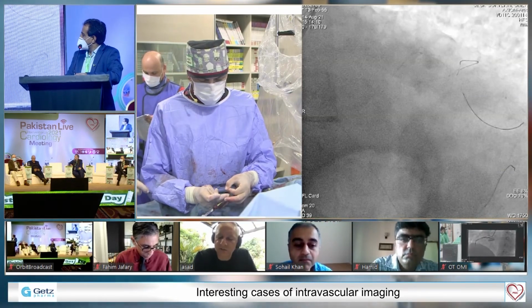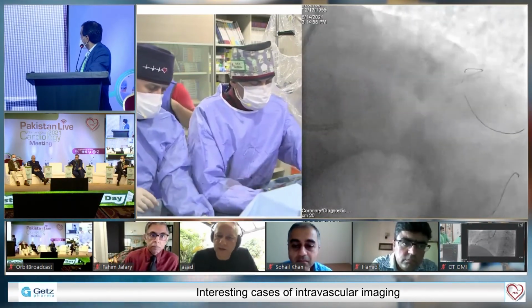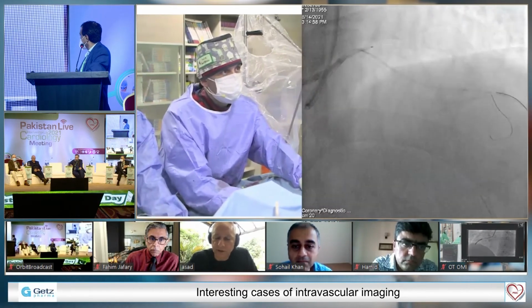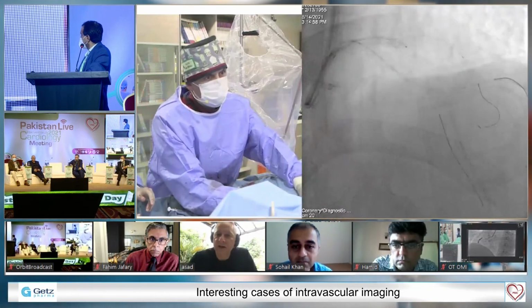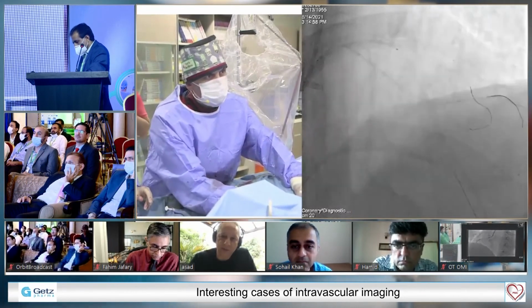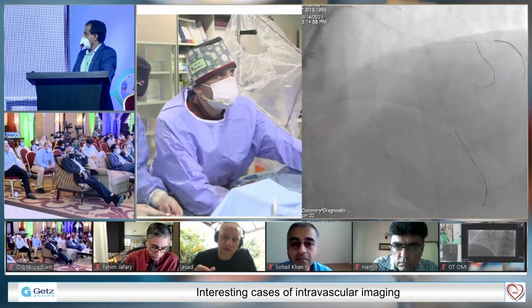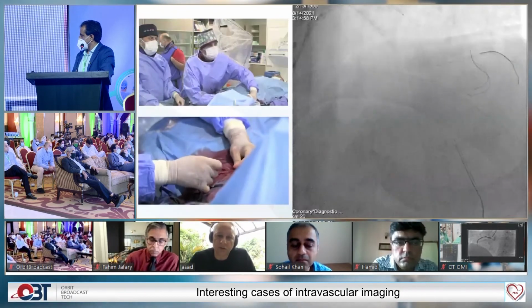As far as safety, clearly the safest retrograde option is to go through a vein graft, then septal, and finally epicardial. They recommend that you should only attempt an epicardial once you've done at least 50 retrograde cases, because the epicardial is a lot more fragile and the risk of injury and perforation is much higher. Plus with epicardial, they nearly always tamponade, whereas septals a lot of times are not serious complications. So keep that in mind, and especially with tortuous epicardial, it's safer to go with a softer wire.